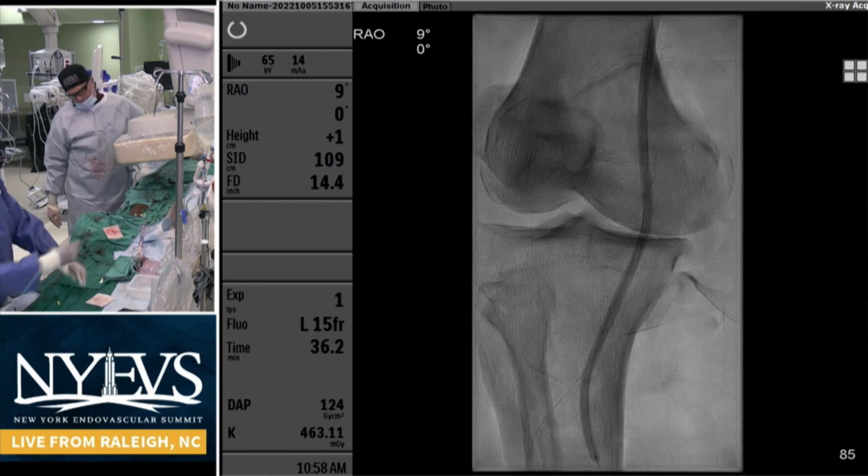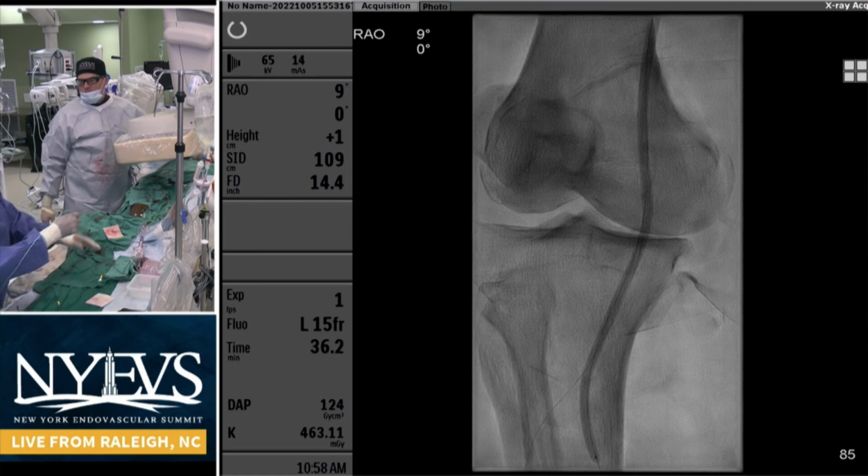What technique do you use actually to put the stents in? Do you go first coronary deployment, telescope your Supera in there, or you put the Supera first and telescope your coronary in there to apply the conduit?